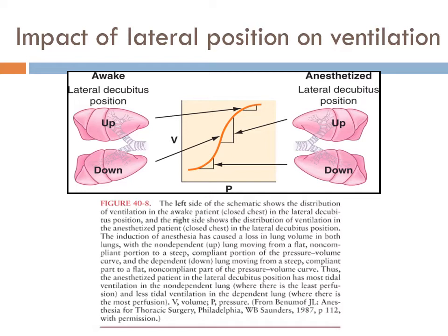So if I do some positive pressure and some PEEP, some airway maneuvers, if I do like 20 to 30 breath holds for maybe 30 seconds, vital capacity breaths, I can say, okay, that lung is real small, because this is just like, say, the circumference of the lung, and it's kind of sagged down a little bit because we've de-recruited a ton, right? But if I start to give those big vital capacity breaths, I put on 8 to 10 centimeters of water of PEEP, maybe my surface area then goes to here. I now have more space for capillary alveolar membrane and oxygenation, right? So now I can keep up with maybe the 10 liters of blood flow a minute going through that one side versus the 5 liters.